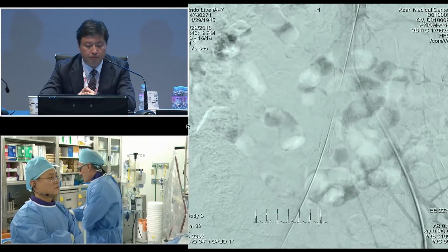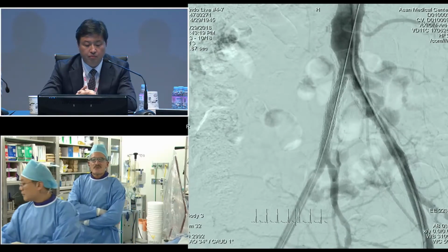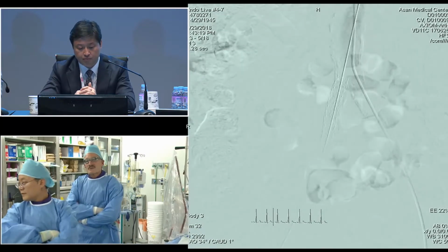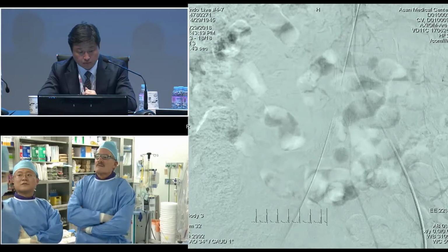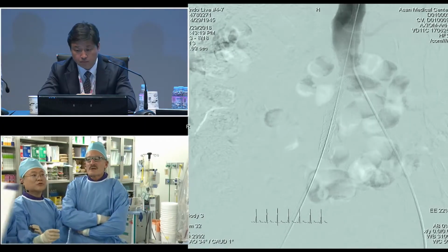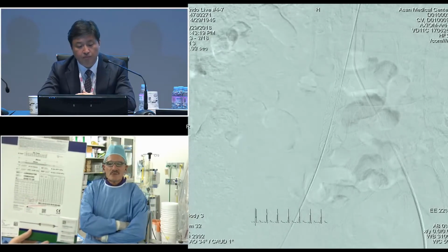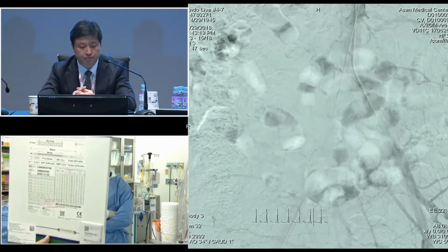We can look on the package and tell you, but certainly you have plus or minus 2 millimeters minimum with the LifeStream. As I recall, the 7 can go to a 10. Here's your box, but there's no issue going 2 or 3 millimeters larger. So this expanded very well.